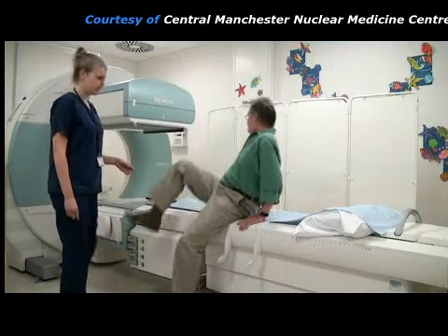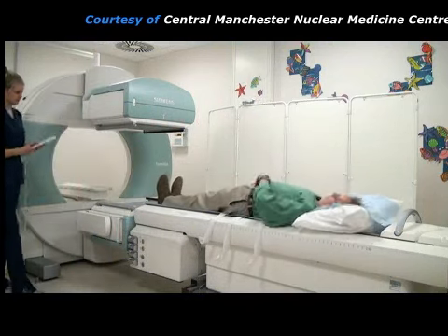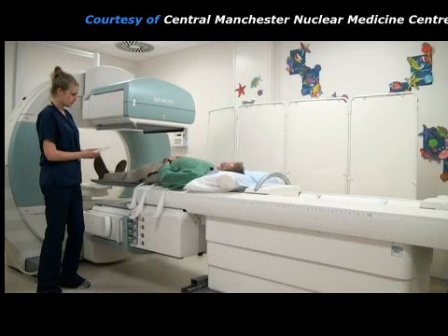This is the gamma camera that will be used to take the pictures of the patient's kidneys. The patient lies on the imaging couch and makes himself comfortable. The couch is then moved close to the gamma camera detectors.